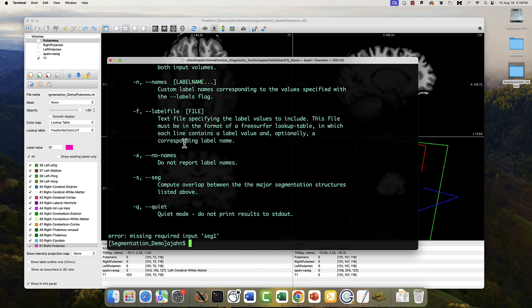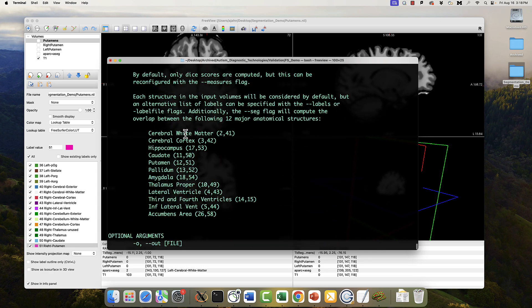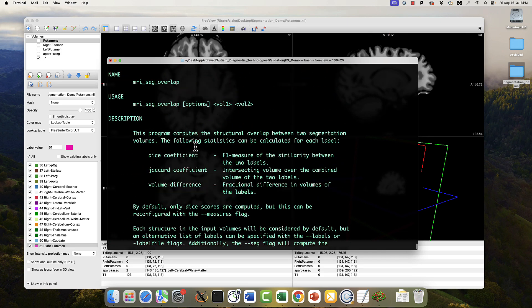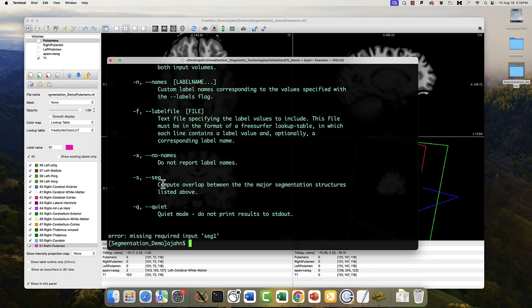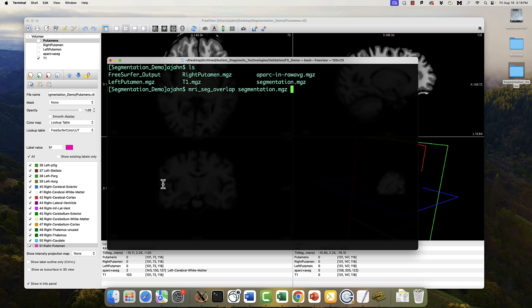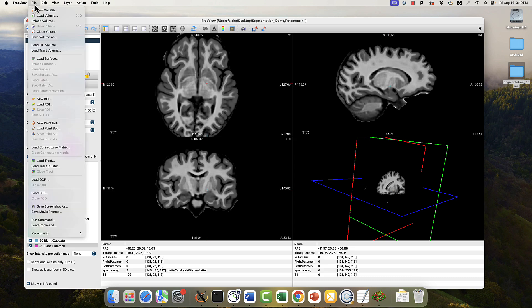We can then use a command called MRISEGoverlap, I'm showing you the output from the help here, to calculate the dice coefficient, which will be output by default. You can also do the Jaccard or another coefficient if you want, but for now we're going to stick with the dice coefficient. So type MRISEGoverlap, and then I'm going to give this input of a manual segmentation I did, and also the APARC in raw AVG. That's the co-registered APARC plus ASEG image.